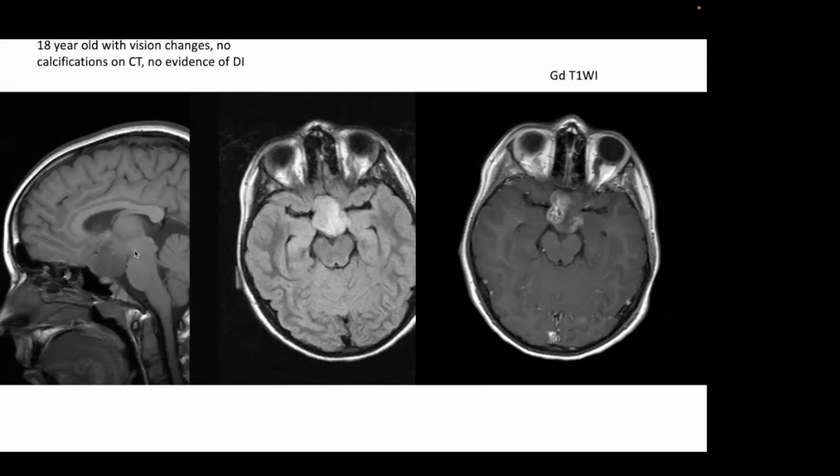So the things again. And what about fat? I'm sorry. Maybe craniopharyngioma. I think it should be hamartoma, not hematoma. Yes, hamartoma, but it enhanced, like on T1 I can see enhancement, maybe not whole, but it partially enhanced. It's hyperintense on T1. I don't know, maybe hamartoma. But typically they're really just normal. They're called hamartomas because they're kind of disorganized, but still histologically normal tissue.